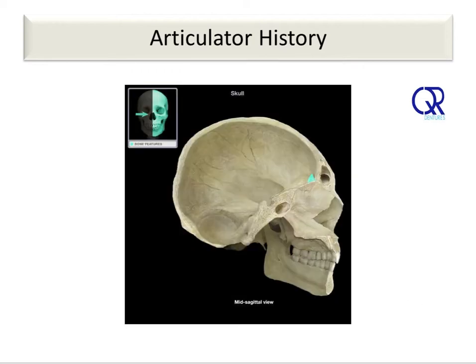It was based on the concept that the mandibular teeth move over the occlusal surfaces of the maxillary teeth, as over the external surface of a segment of an 8-inch diameter sphere, and that the centre of the sphere is located in the region of the crista galli. The crista galli is a median ridge of bone that projects from the cribriform plate of the ethmoid bone.